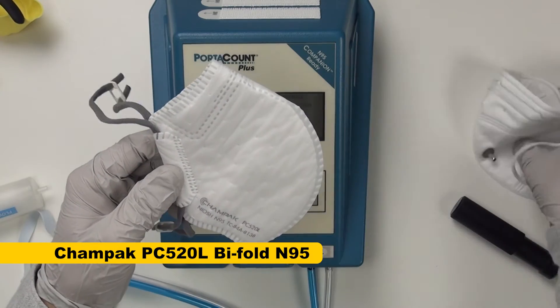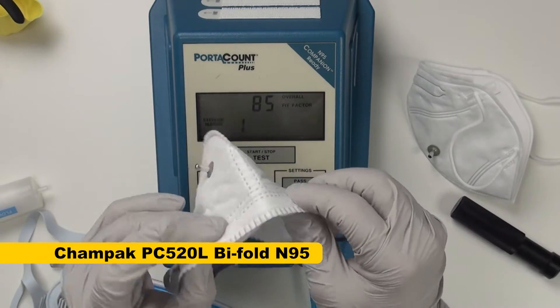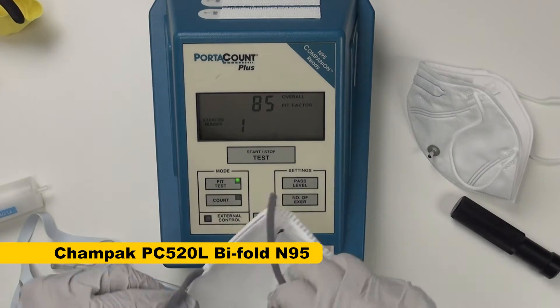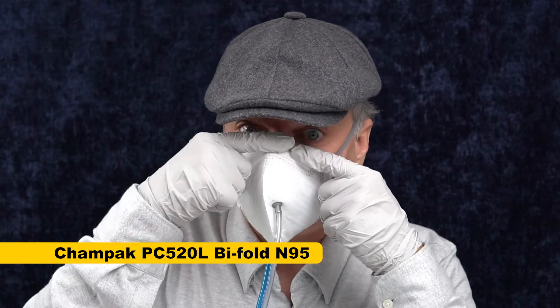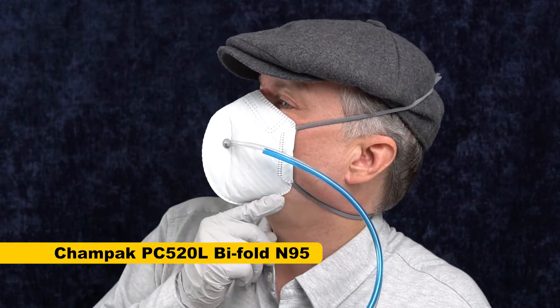Next up is the Champak PC-52 OL. This is another vertical bifold mask, similar to the KF94 but a bit deeper in shape. It's got a bit of nose foam inside, the nose wire is on top with an encased nose foam. Instead of a behind-the-neck strap, it has individually adjustable straps that pull through, which is not my favorite method because they tend to get out of balance on me. One nice thing about the Champak: they did not have that really sharp angle in the nose wire — I don't have to flatten it. This fits a lot better in terms of seal, though the mask is too short for me to really even talk in it. It does seal better under the chin because it goes further back.